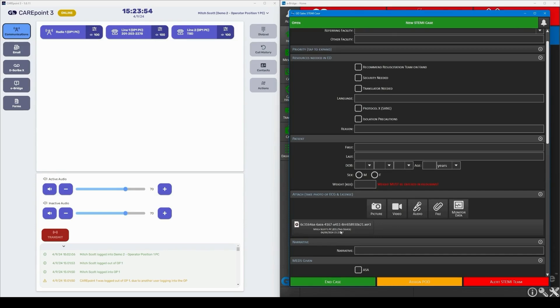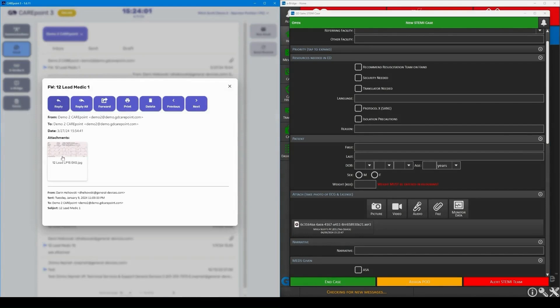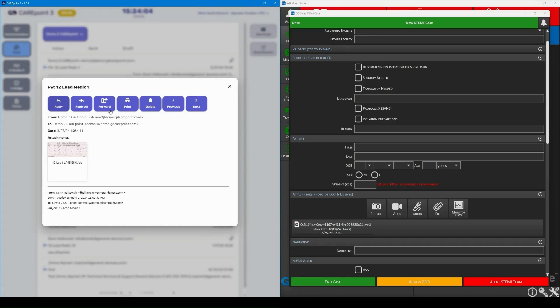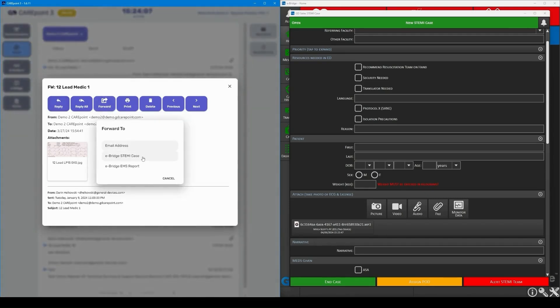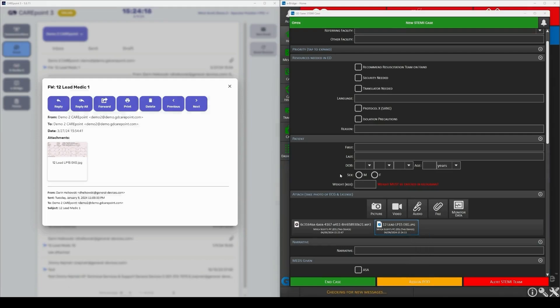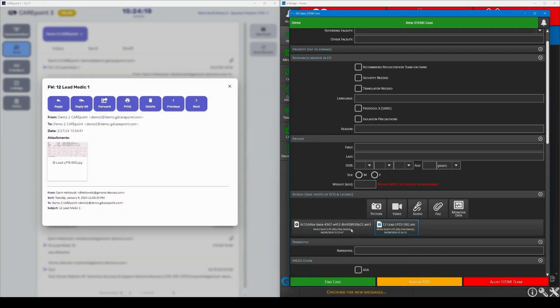Now, let's get that 12 lead that EMS emailed us. We can open up the email here in CarePoint, view the 12 lead and forward it over to our eBridge case, just like we did with the call earlier. It is going to populate here, right by the call, instantly, where the emergency department team can open it up to view the 12 lead and decide if it is a STEMI.